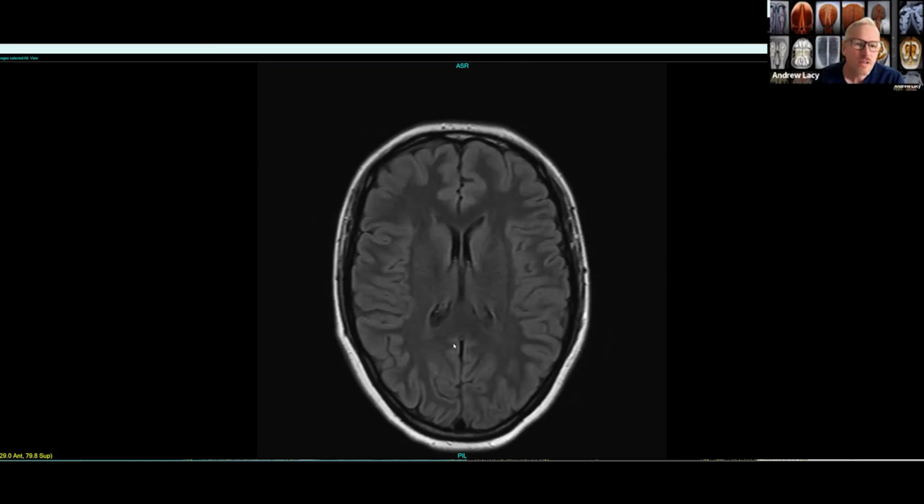There's one really important thing to talk about that some folks are a little confused about on the chat, potentially, which is we don't need a physician referral to do these scans. If you're interested in a scan, you can reach out directly and book on the website or book with our team. Then we have a medical practitioner who does an appropriateness review just to make sure that there's not any particular contraindication for an MRI scan. For example, we don't presently scan patients that have pacemakers. But I would say the overwhelming majority, the high 90 percentile of folks, are able to do these scans. There's no contraindication. And then they also do a review for the reason for the scan.